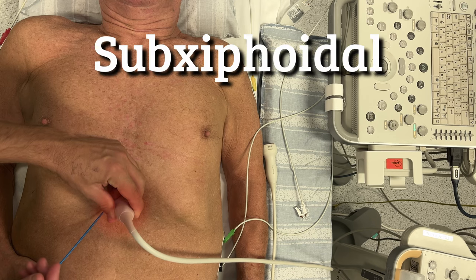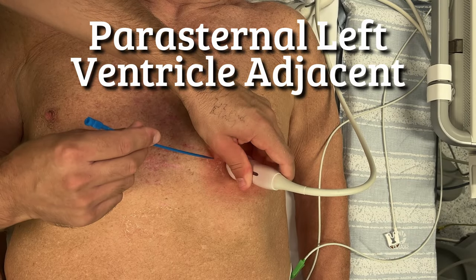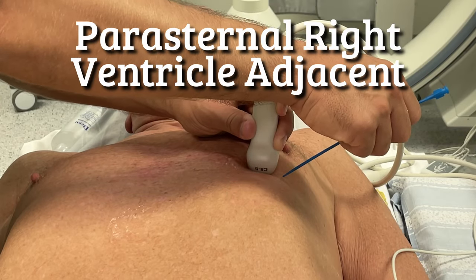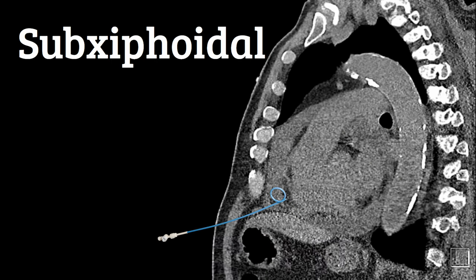Sub-xiphoid, the parasternal left ventricle-adjacent, and the parasternal right ventricle-adjacent. Sometimes there's only one approach that works in your patient, therefore you need to master them all. Note that shifting the patient's position will move the effusion, and new approaches may become viable. The sub-xiphoid approach is never our first-hand choice, due to the risk of puncturing the liver or stomach. Also note that the puncture direction is straight towards the right ventricle, and accidental punctures have happened.